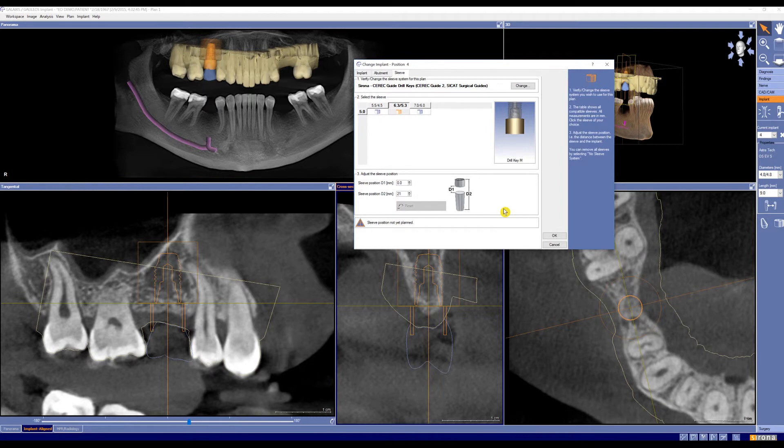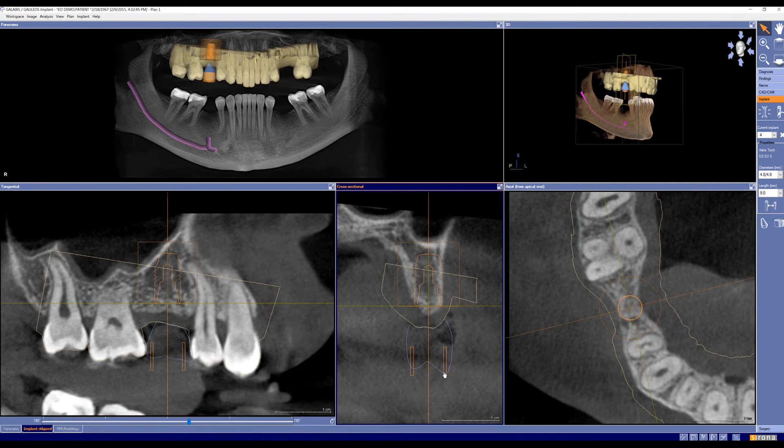The D1 value will be automatically set based off of our D2. From here, I have the proper diameter selected for our sleeve and sleeve position D2, so I can press OK. Now you see our sleeve has been moved accordingly based on our plan.